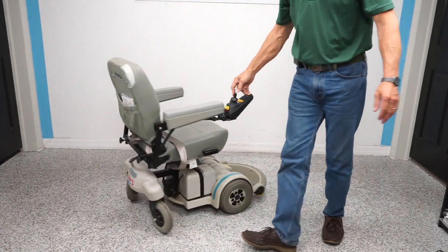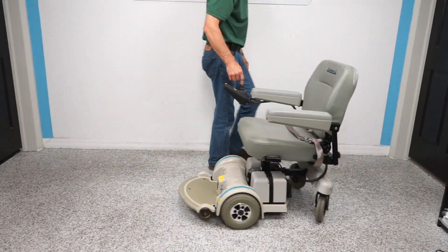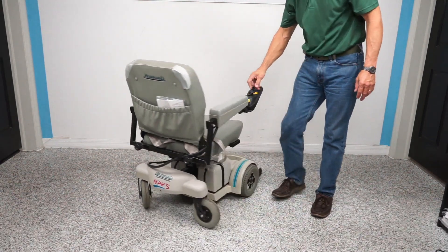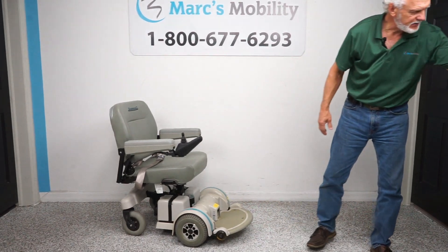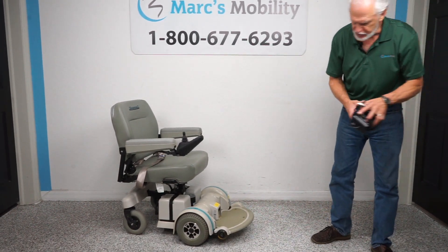This is your turning radius in your house — come over here. This is what it would look like when you turn in your house.